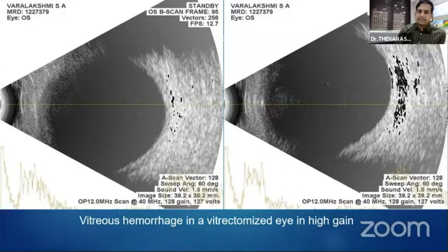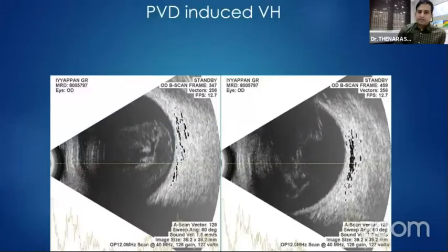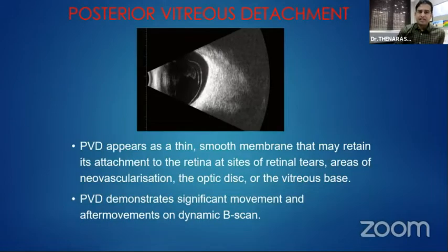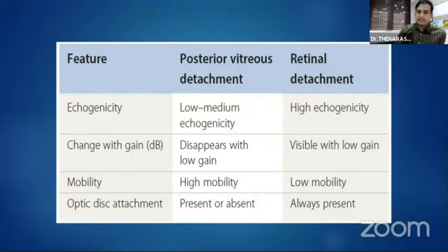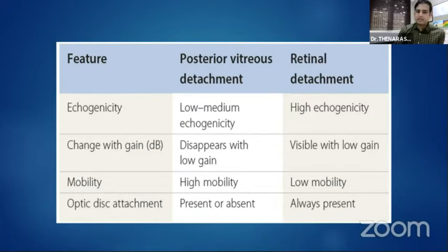In post-vitrectomized eyes with re-bleed, vitreous hemorrhage is very difficult to pick up — only by increasing the gain can we see mild-to-moderate vitreous dot echoes. In PVD-induced vitreous hemorrhage, the first picture shows a complete PVD and the second picture shows incomplete PVD. To differentiate PVD from retinal detachment: in PVD you see a thin line that disappears when you reduce the gain, whereas in retinal detachment the reflectivity persists even after reducing the gain. In retinal detachment, the retina is always attached to the optic disc, whereas in PVD it may or may not be.